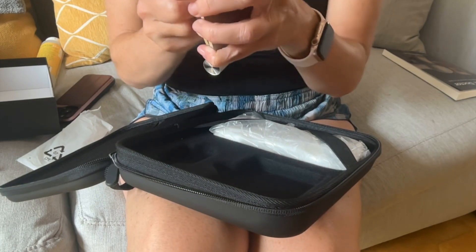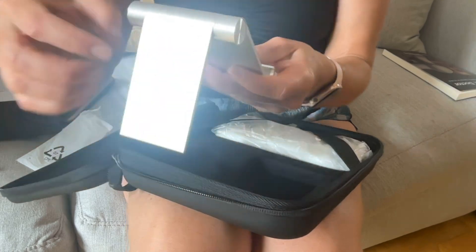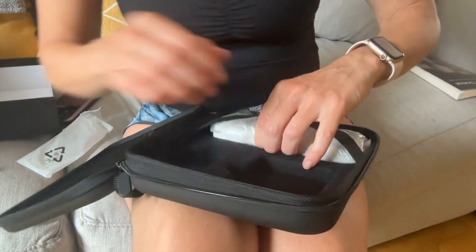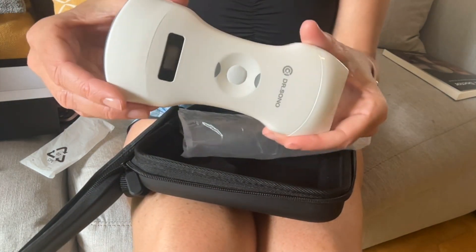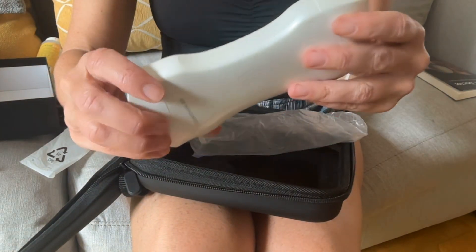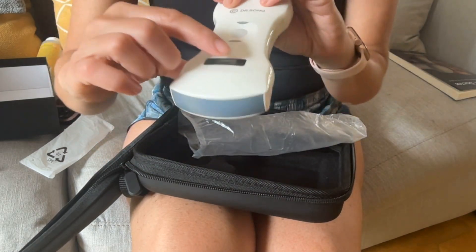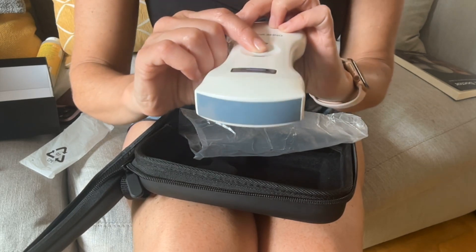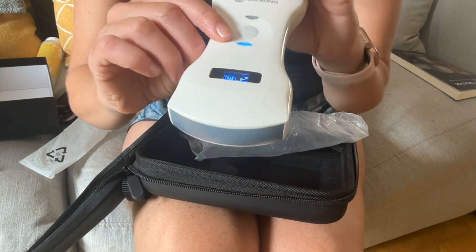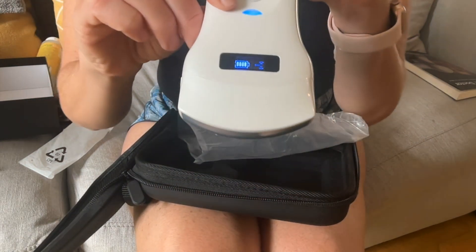There's this nice little stand for the phone, for when you use it, or for your iPad, which I'll show you later. Here's your device — it just has this one button and two blue light indicators. This is where you see how much battery you have and when you're connecting. My battery is at full charge.